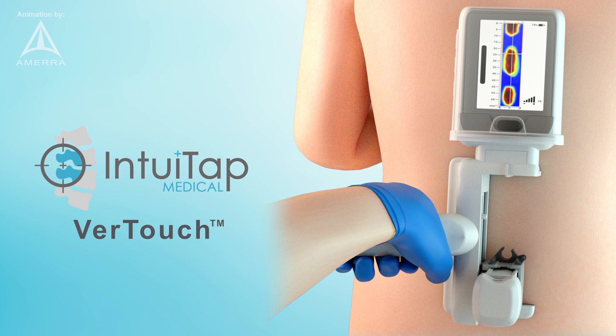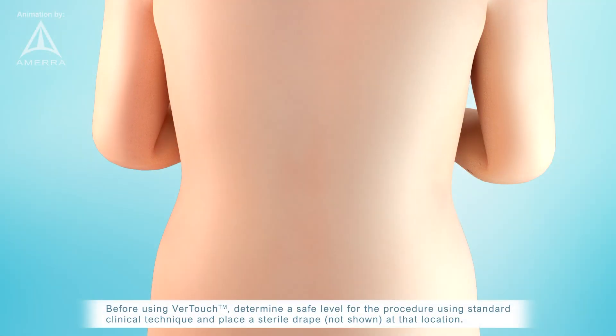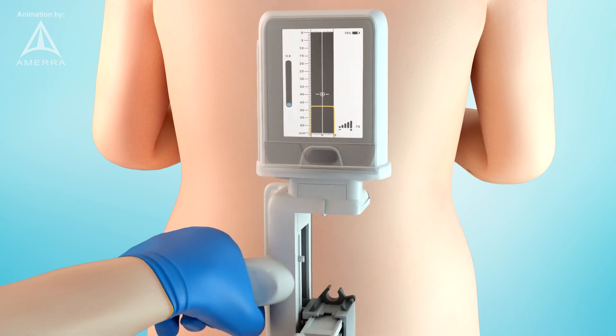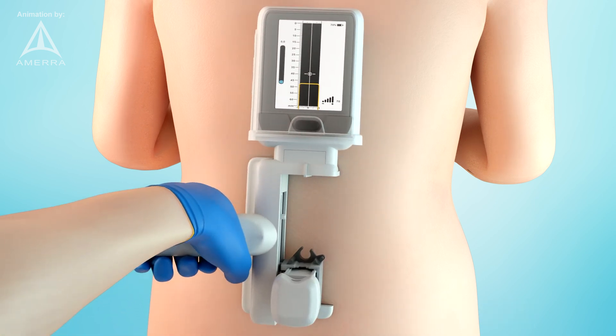The Vertouch device helps providers place spinal needles for neuraxial procedures including lumbar punctures and epidurals. After assembling the device for use in the sterile field, place the device against the spine, aligning the midline indicators on the physical device and screen with the approximate patient midline.